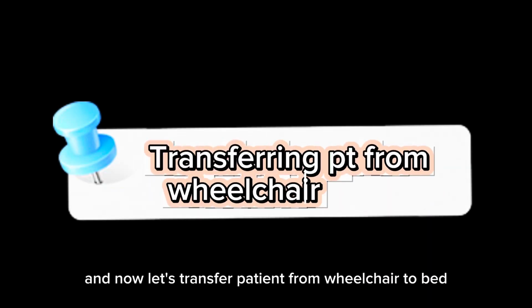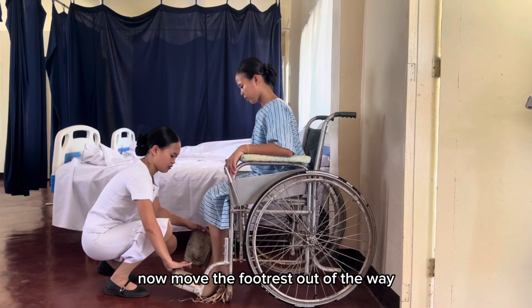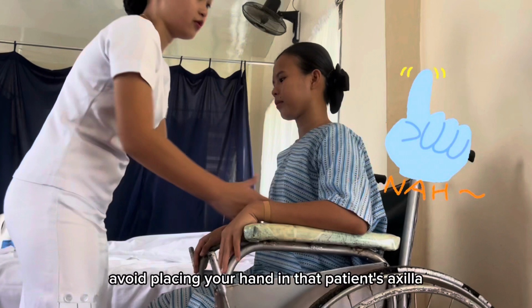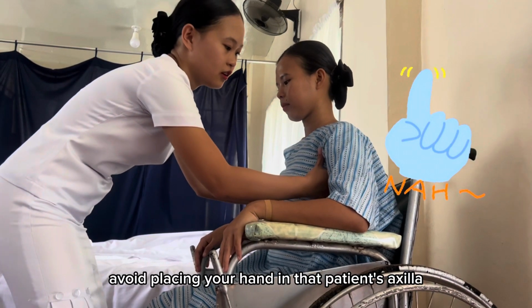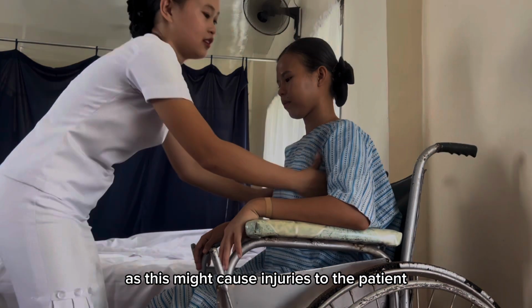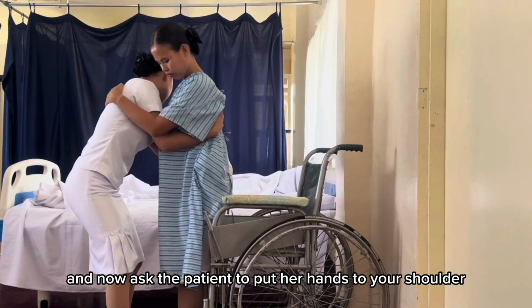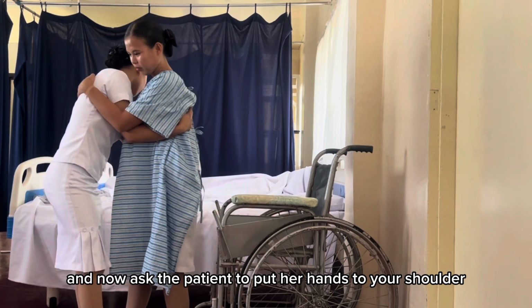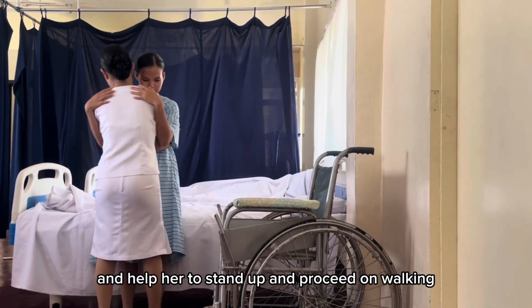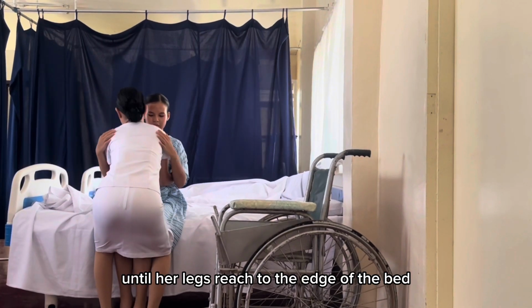And now, let's transfer the patient from wheelchair to bed. Now, move the footrest out of the way. Place your hand at the back of the patient. Avoid placing your hand in the patient's axilla as this might cause injuries to the patient. And now, ask the patient to put her hands on your shoulders and help her to stand up. And proceed on walking until her legs reach the edge of the bed.